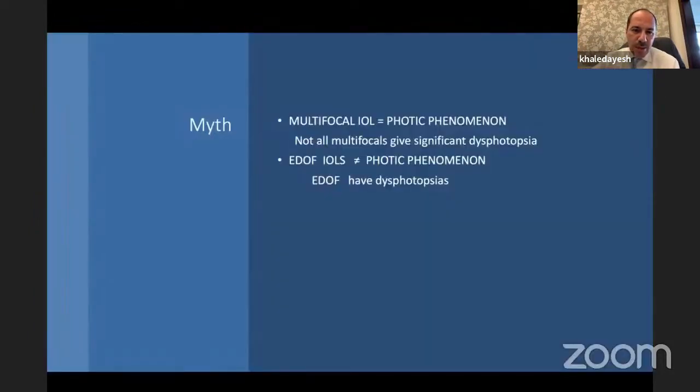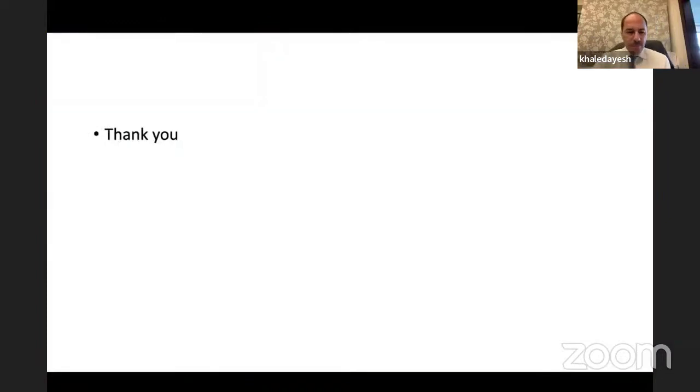And by this, I will conclude that not every multifocal lens is associated with photic phenomena, because many patients are happy and they do not complain of photic phenomena. And on the other side, EDOF IOLs are not free of photic phenomena. Thank you very much.